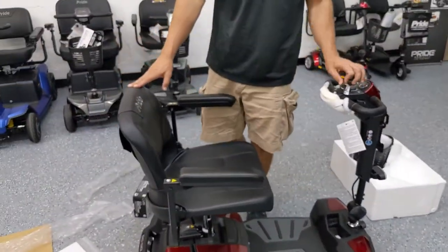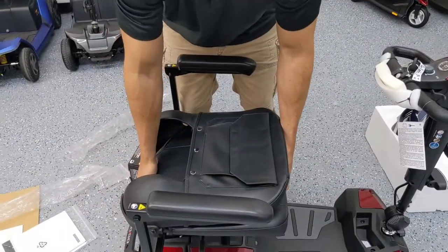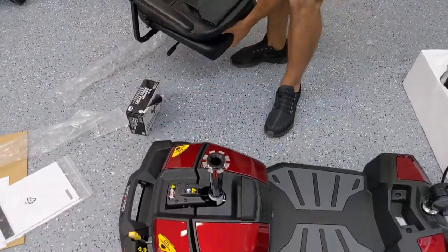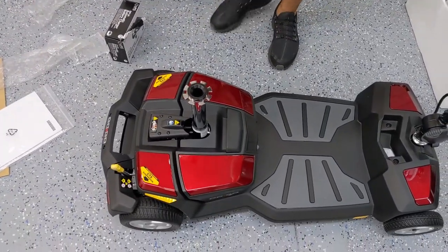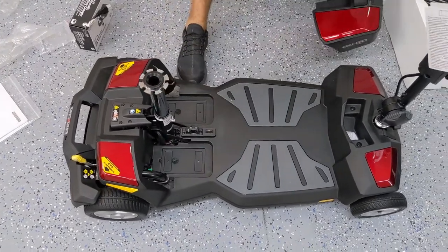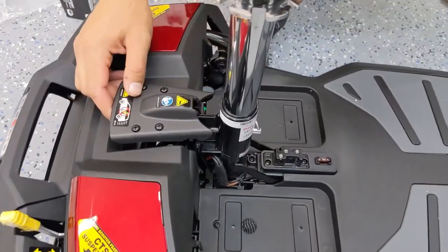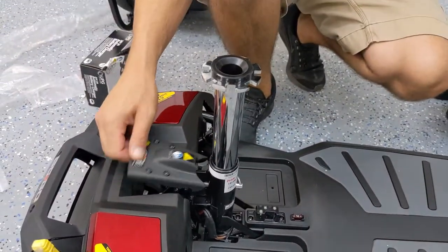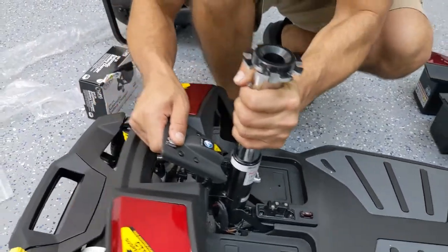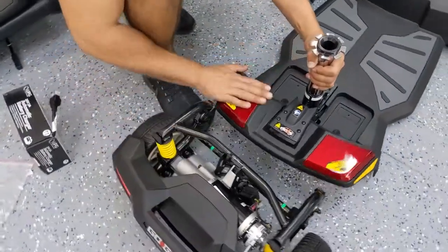To take it apart, you start with the chair. Make sure the unit's off. I like to fold the chair forward, grab it by the back where the accessory port is and underneath the front, and pull straight up. The next step is to just grab the battery by the handle and pull straight up. Get it out of the way. Next, you take this latch, lift up with your other hand, and pull away. That is going to separate the rear half — which has the motor — from the front.